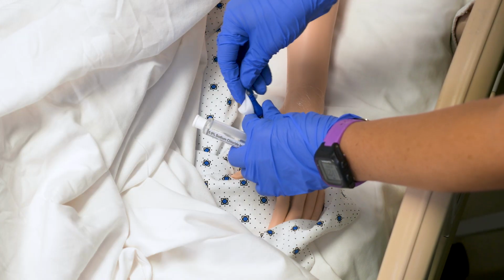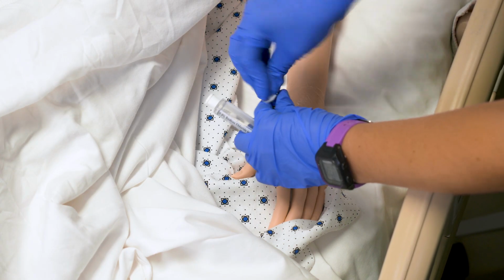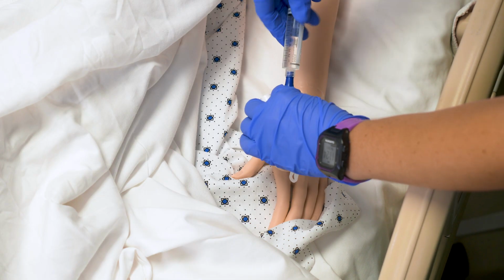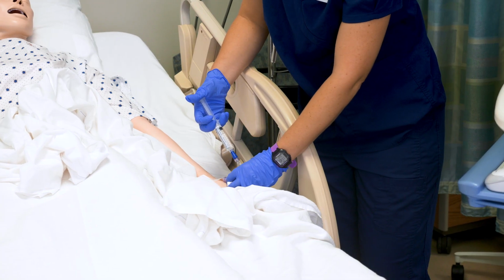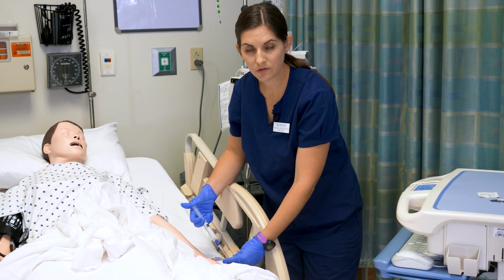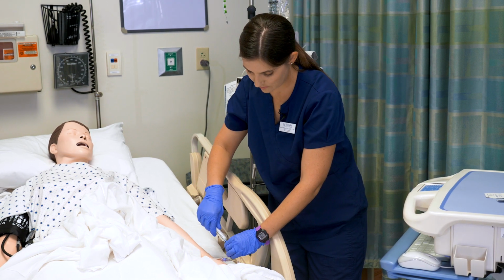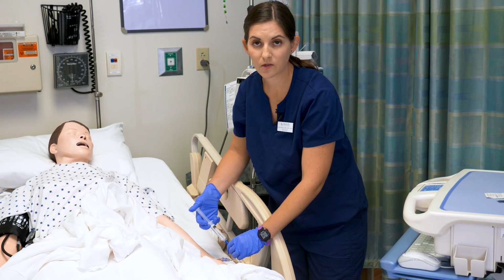I'm going to scrub the hub for 15 seconds because I did put down my end cap on my port. Okay, allow it to dry. I'm going to go ahead and flush with my 5 mLs. So depending on the type of valve that you have in your peripheral IV lines, you may need to clamp with positive pressure, or you may have a positive pressure valve where you would disconnect your syringe and then clamp. So you want to follow whatever type of valves that your hospital uses.